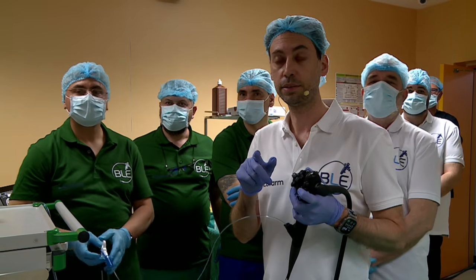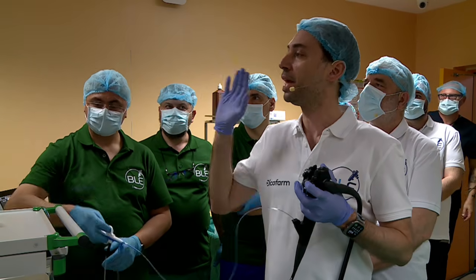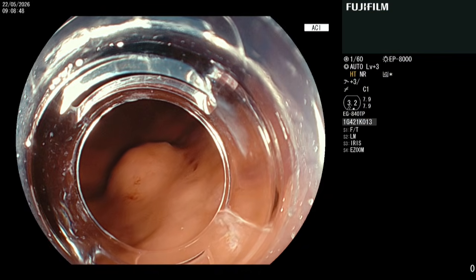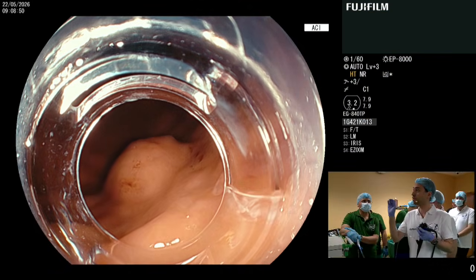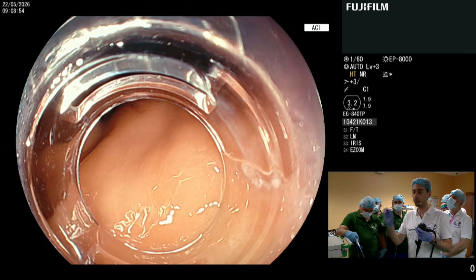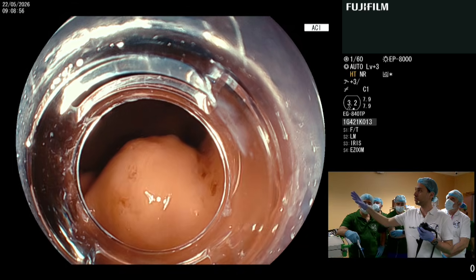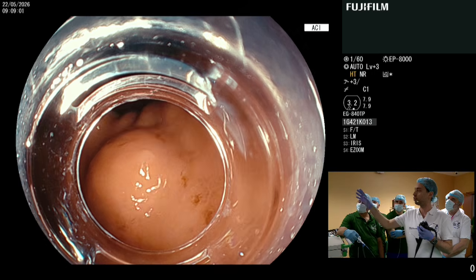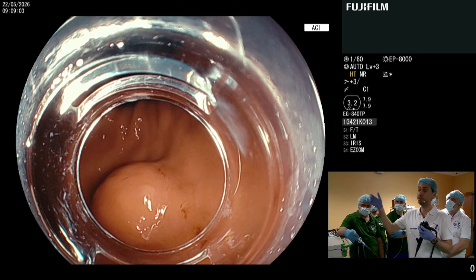Thank you. We are hearing the RC, yes. All right, perfect. So this is the lesion. When we appreciate such a lesion, we have to understand in our mind whether the lesion has an extraluminal component. When we see this lesion, it looks like 50% of the lesion is inside the lumen and 50% outside.